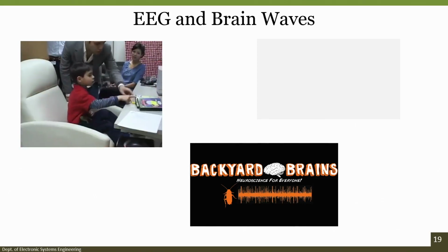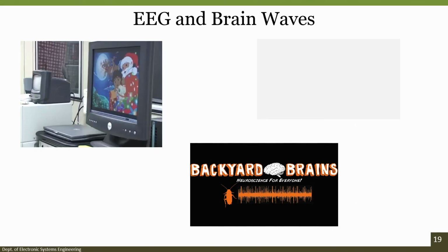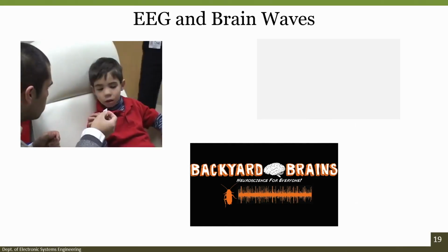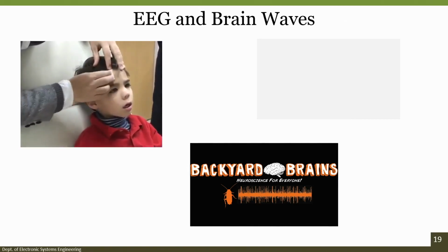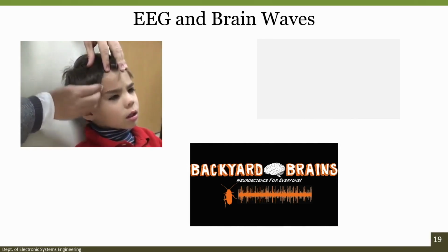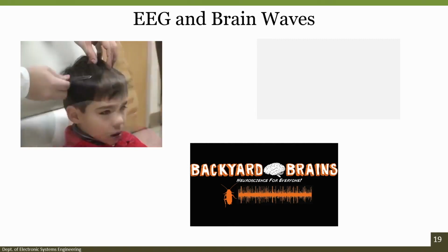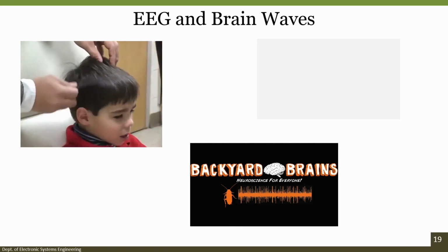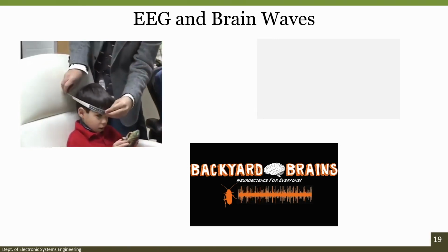When playtime is done, you'll sit in a big white chair and pick out some cartoons you'd like to watch. You'll get to watch the first cartoon while Nate gets you ready for your cap. First, he'll have to clean around your eyes and behind your ears with a wet cloth. Next, he'll brush your hair and measure your head to be sure exactly which cap will fit you best.